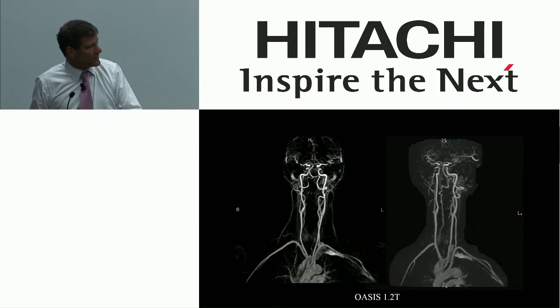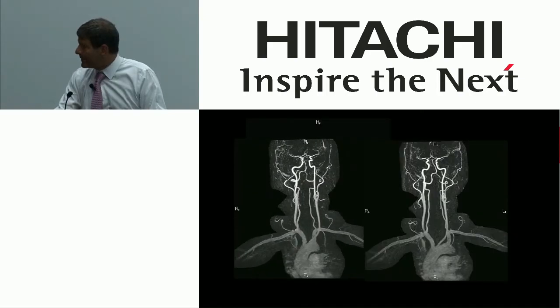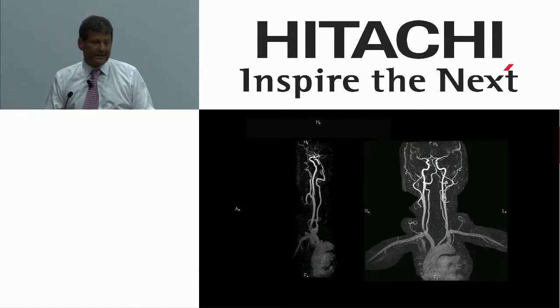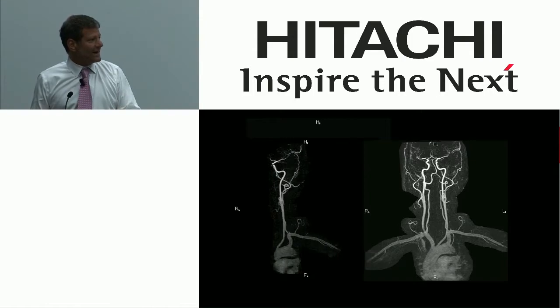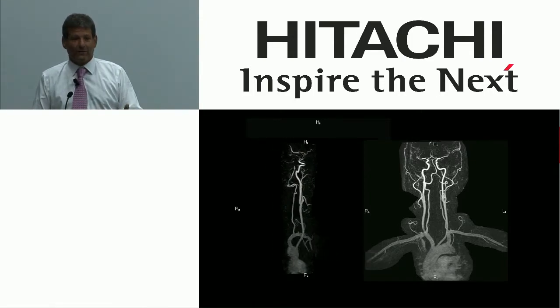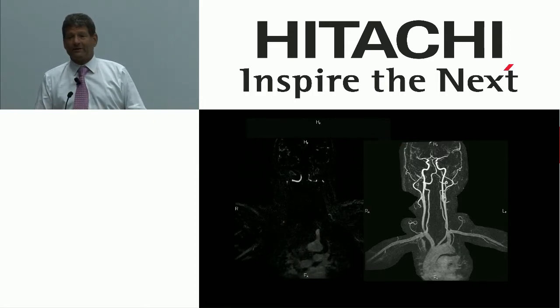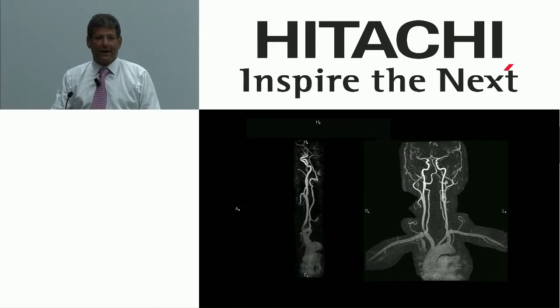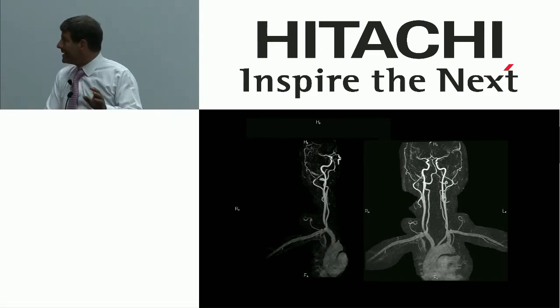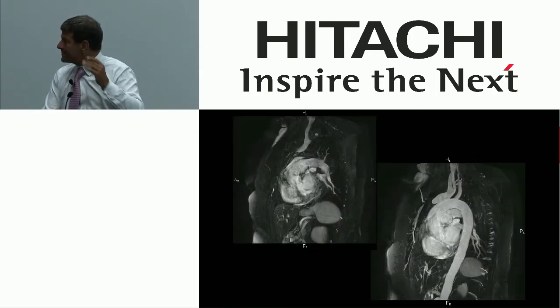But contrast MR angiography, just like you'd expect a high field system to perform. Not particularly special. This is the imaging protocol that rolls out to every RadNet site in the country. So if all of a sudden I have bad image quality somewhere because something's happened, a mouse has crawled in with a tinfoil lunch or something, I know that my protocols are set and we can go in and see if there's an issue with the system. But this is the kind of work we expect to be able to do.